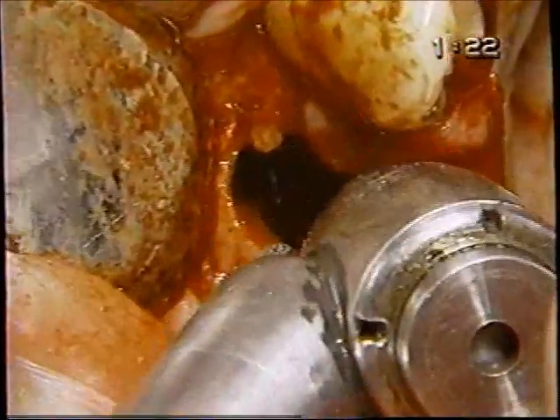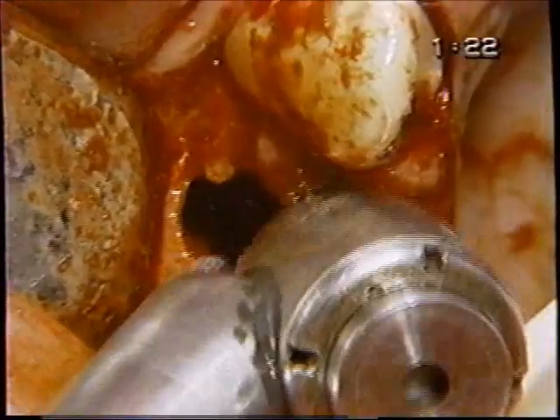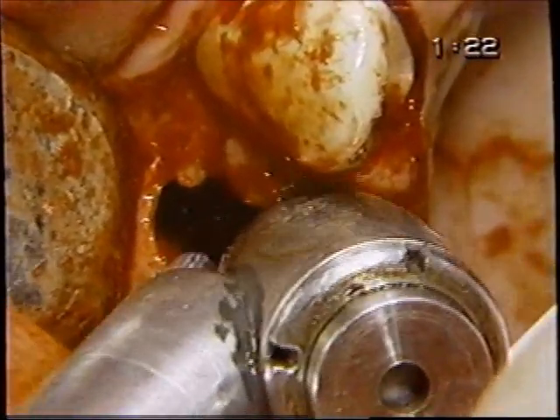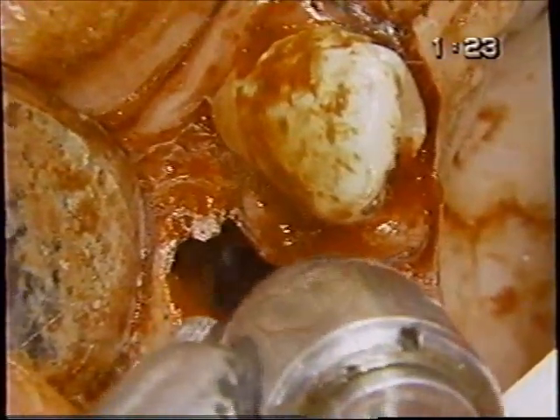Now, what do we do next? Put the burr down clear to the depth of that socket, and I'm not planning on going any further. To do so wouldn't be prudent because of the location of the sinus, but what I'm going to do is go down there and just with tactile feel, knowing where I am, come facially. We're removing inter-radicular bone again.